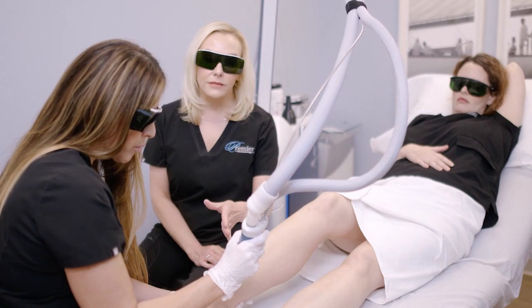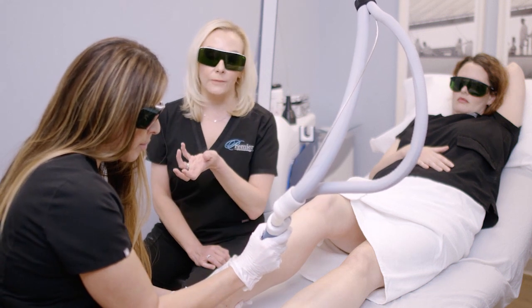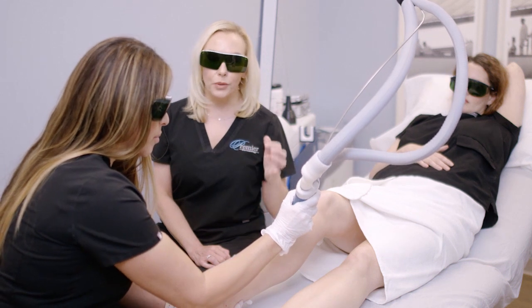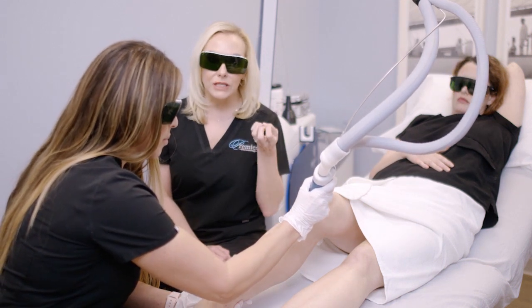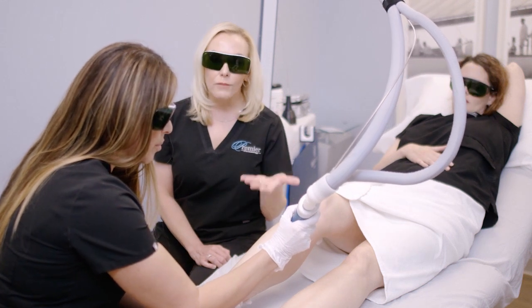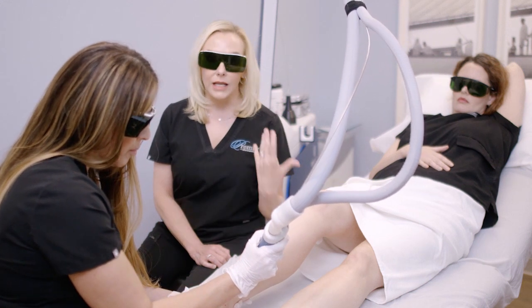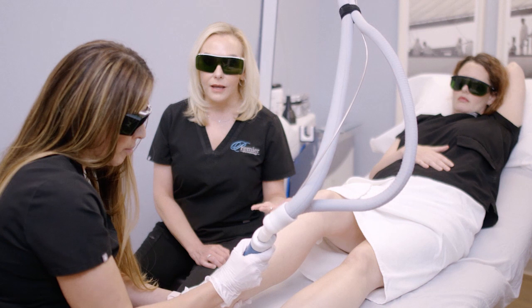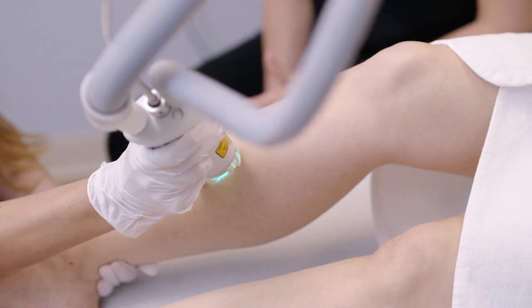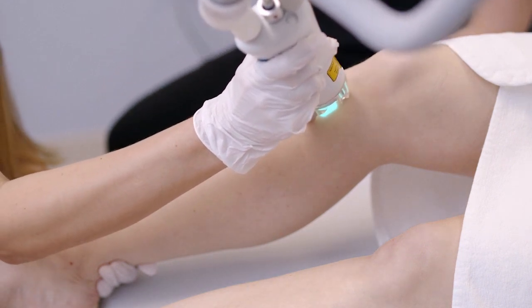It also has a feature that a lot of laser devices have, which is a suction feature. As the laser hits the hair, there will be a little singe or a plume as that energy is being absorbed by the hair. And so that suction removes that plume, so it makes it very safe for the operator and anyone else in the room. You're not getting cells from the patient that you might potentially inhale like you have in the past with some of these other devices. So that's why you don't see us wearing a mask or anything like that with this device.